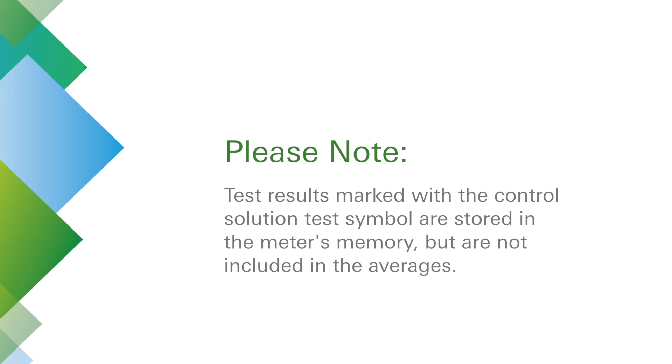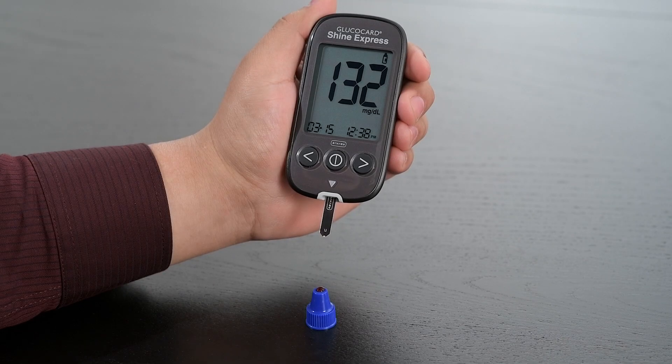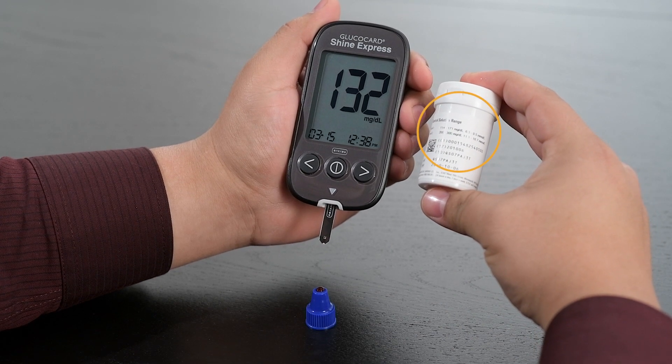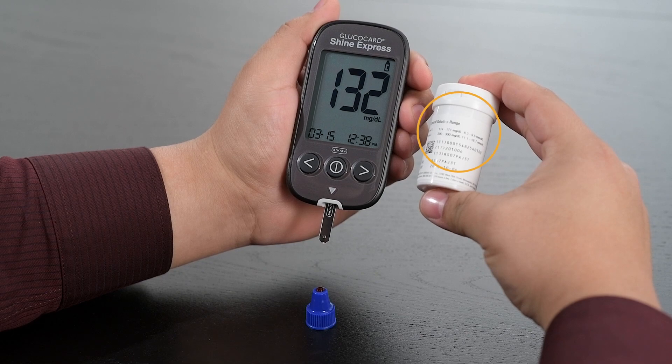Test results marked with the control solution test symbol are stored in the meter's memory, but are not included in the averages. Compare this result with the control solution range printed on the test strip vial. The result should fall within that range.